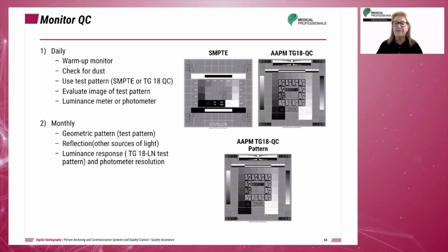Luminance, reflection, noise, and glare can be evaluated with a luminance meter or with a photometer and the test pattern. There are a number of AAPM TG18 test patterns that are available for testing other imaging modalities and additional aspects of the PACS.